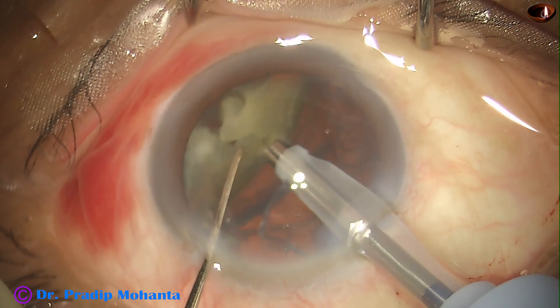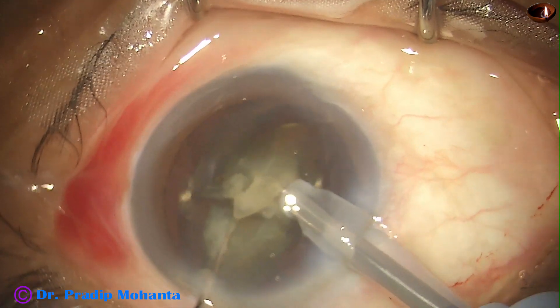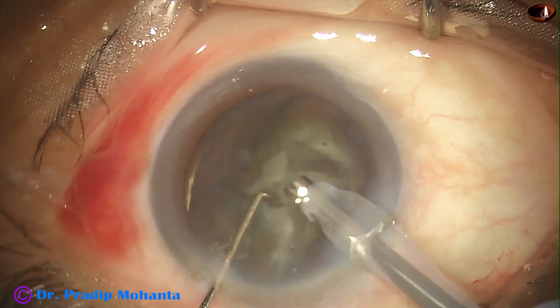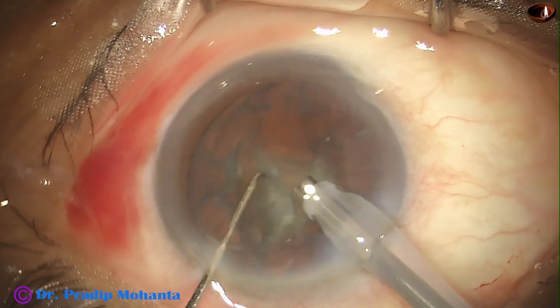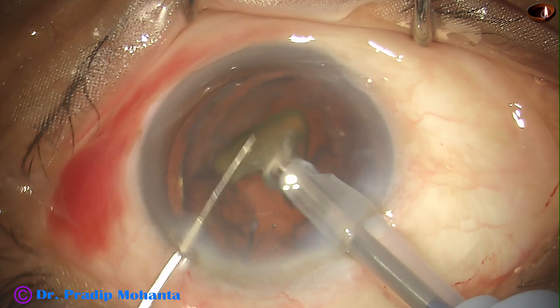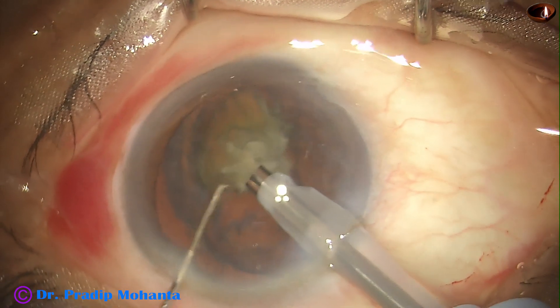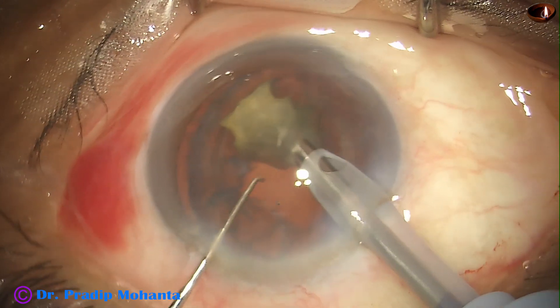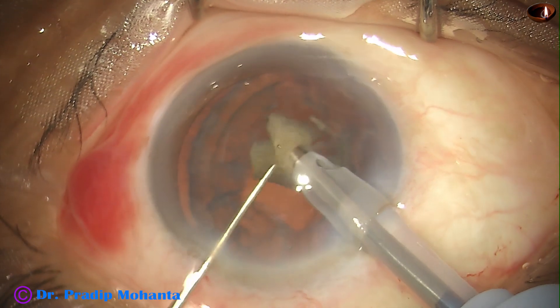Here there is a little joining — it is broken. Now each nuclear piece is held and emulsified. I am very careful and very slow with this machine, as I have not been using it for very long. But I find that the anterior chamber stability is excellent. There is no surge, and I can quite comfortably emulsify the pieces.